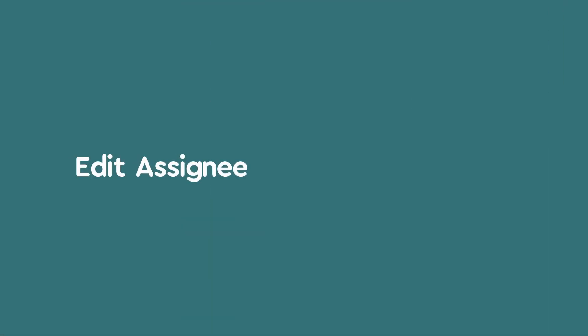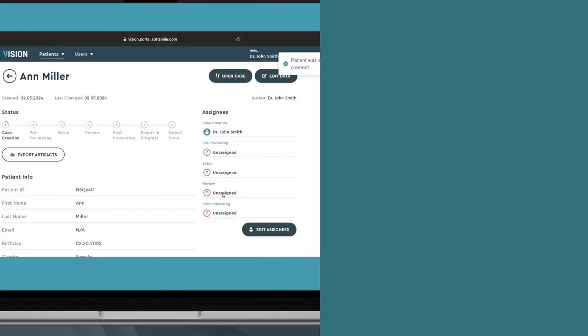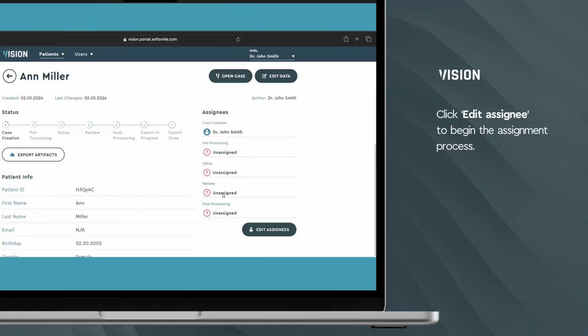Next, go to the patient's profile and click Edit Assignee. This is where the journey begins.